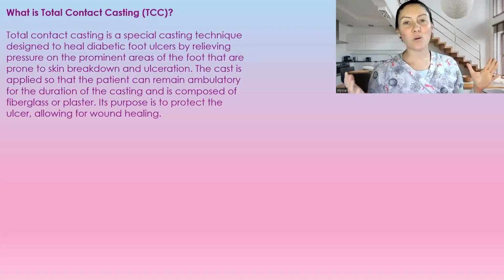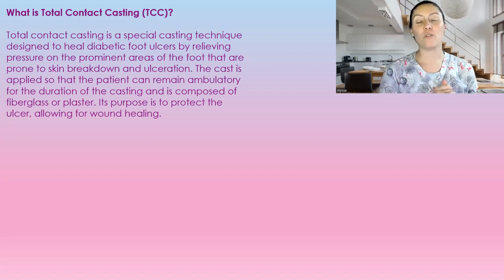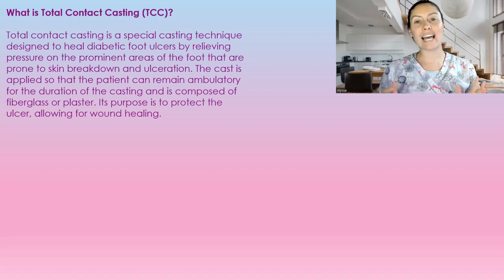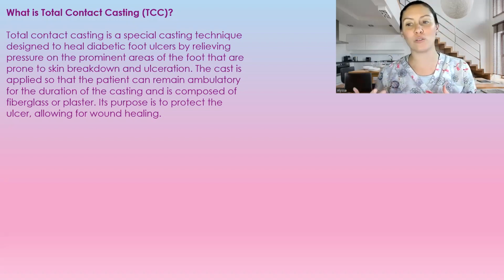So what is total contact casting? Either this is for nurses, or if you yourself have been told that you are going to have total contact casting, you will know exactly what is going to be going on, okay? Total contact casting is a special casting technique designed to heal diabetic foot ulcers by relieving pressure on prominent areas of the foot that are prone to skin breakdown and ulceration, okay?